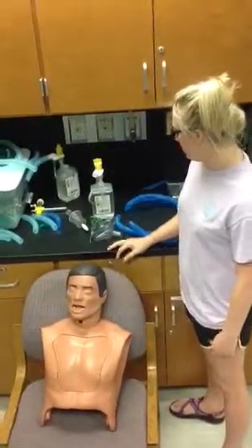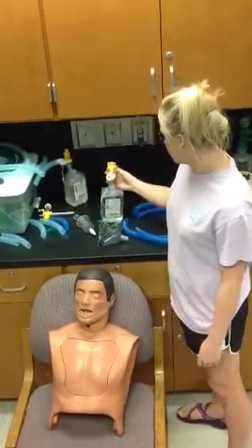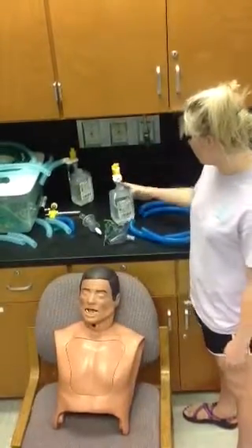We're going to set the patient on 40 liters at 40% oxygen. It tells you right here that you need to put it on 10 liters per minute.